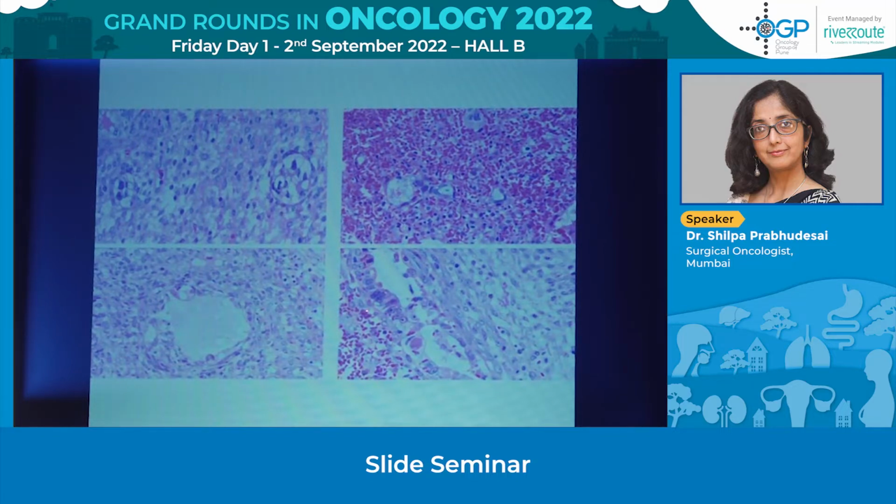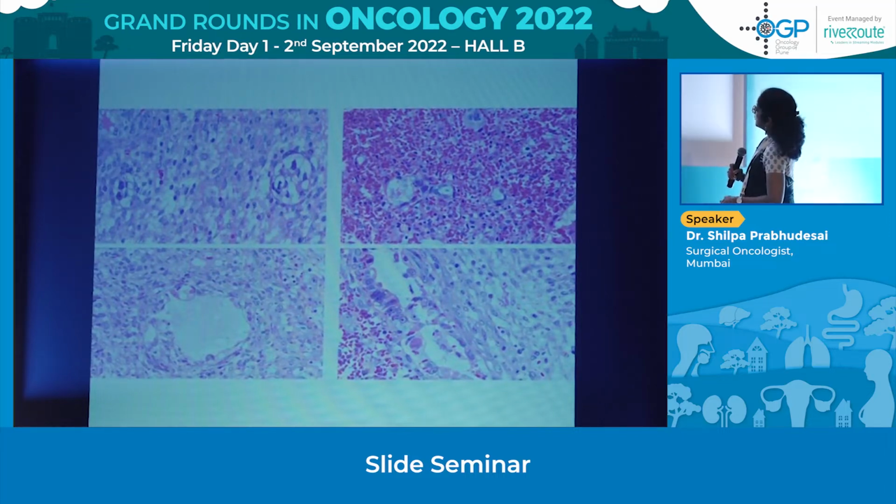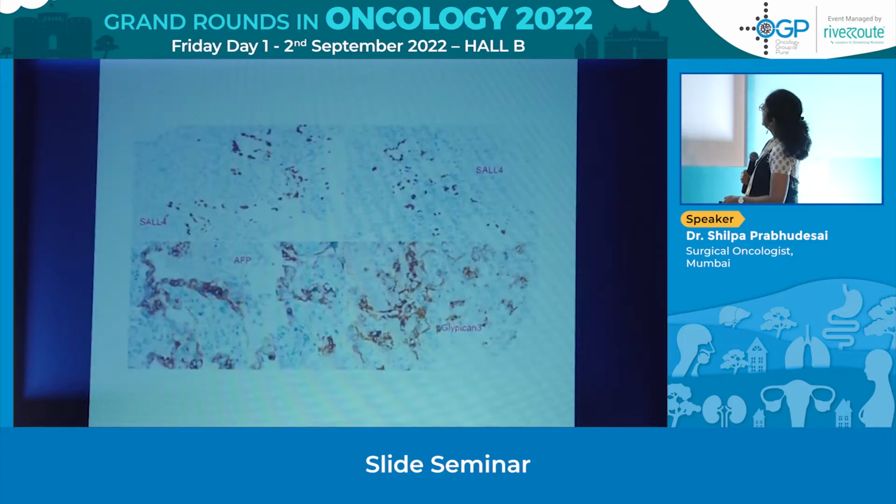We can see these large atypical cells, some of them with clear cytoplasm, pleomorphic nuclei which are lining these spaces and somewhere scattered within the stroma. These were almost inconspicuous. If you saw this case in a hurry, like I did the previous evening, you could miss it. And here is another clue. Here are the hyaline globules that were seen.